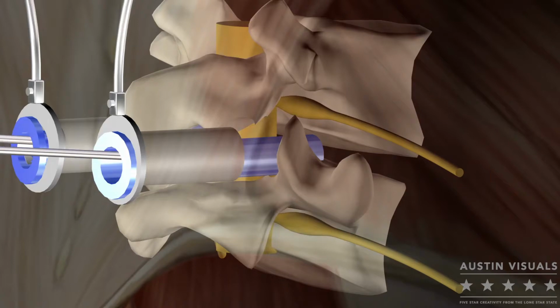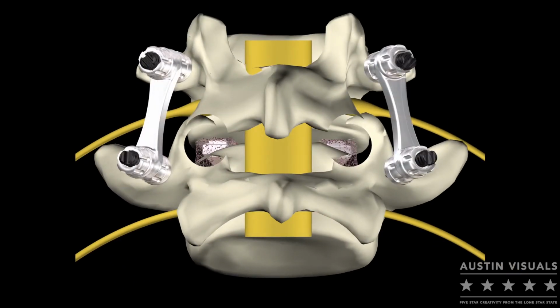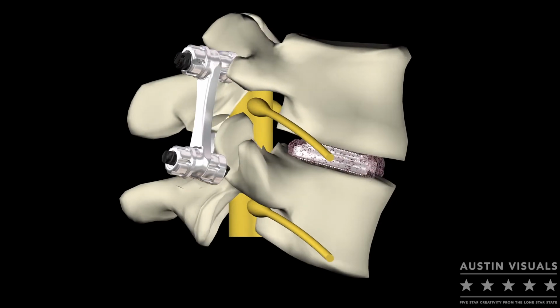The expandable interbody cages are introduced, expanded, and filled with bone graft. Both cages, right and left, are located laterally against the stronger apophyseal rim of the vertebral endplates. Posterior instrumentation with pedicle screws is achieved as the last step. All of this is performed percutaneously, without opening, exposing, or retracting the dural and nerve elements.